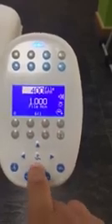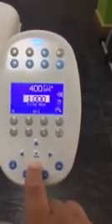Now what's just happened is, because I haven't made any adjustments for a few seconds, it has timed me out of this menu. So what I need to do now is press the plus or minus key, and that will take me back into this menu, and again I can adjust around with these chair positions.